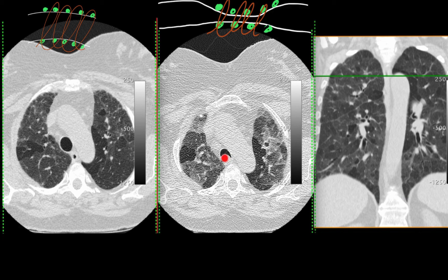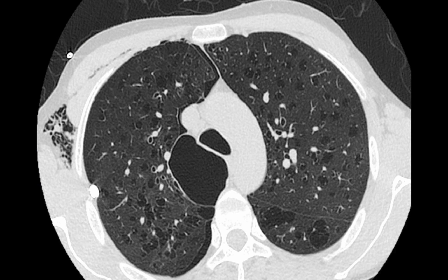Note that on an expiratory HRCT the posterior tracheal membrane falls inward, forming the so-called D shape, as opposed to the normal ovoid shape on an inspiratory film. In the area of air trapping, the arteries in the centre of the secondary pulmonary lobule are much smaller than in the relatively grey lung, because air trapping leads to hypoxia which leads to vasoconstriction. More central lobular pathology: there are lucent areas surrounding the pulmonary artery without a definable wall — this is typical centrilobular emphysema. Note also that this patient has surgical emphysema, a pneumothorax, and a large paraseptal bulla, with the intercostal drain visible in the pleural space.